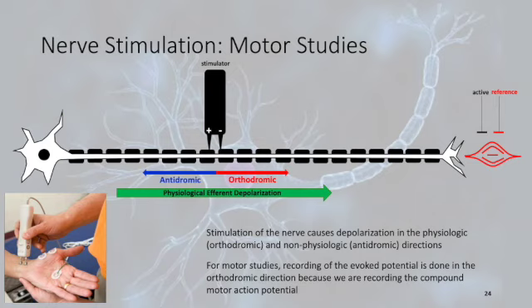In this next section, spend some time with this. There's a lot of terminology here, a lot of different words that guaranteed you haven't seen before, or if you have, you haven't seen them a lot. Understand just what's happening. Understand that we're measuring the electricity from the cell body down the axon down to the dendrite. That's what we're doing.